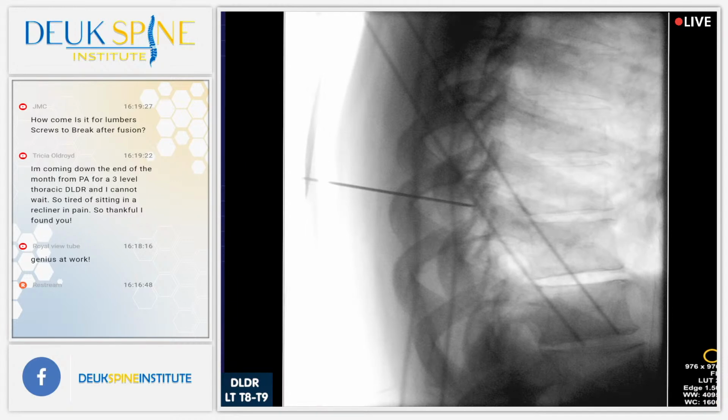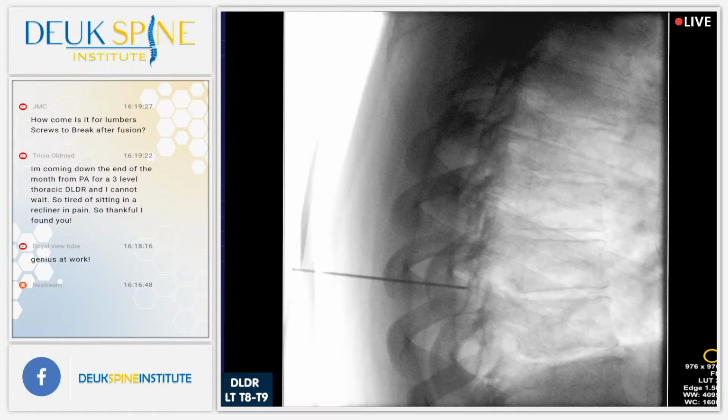All right. Any way you can get that lined up better? I think we're off on wag. Somehow he's moved a lot. I think that's better, right, Luis?